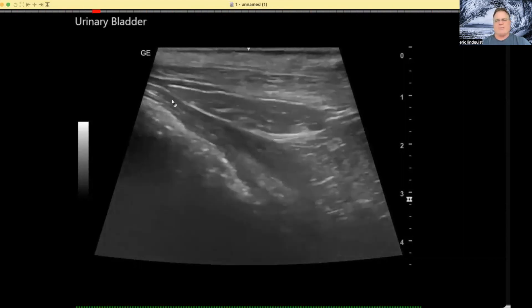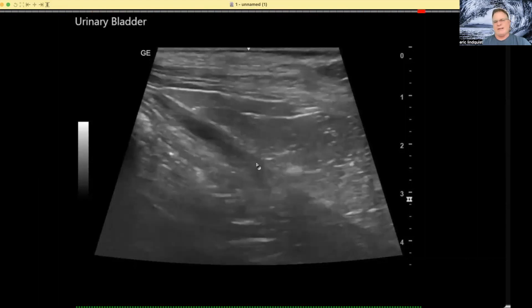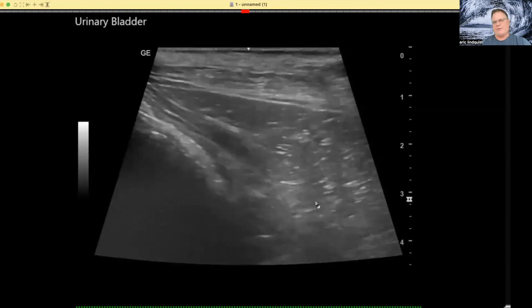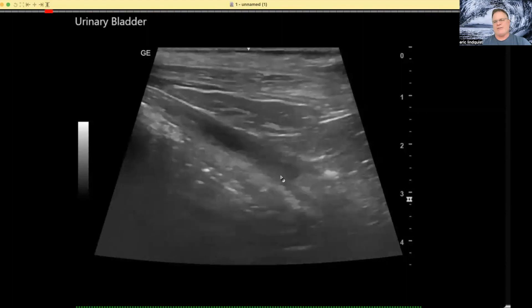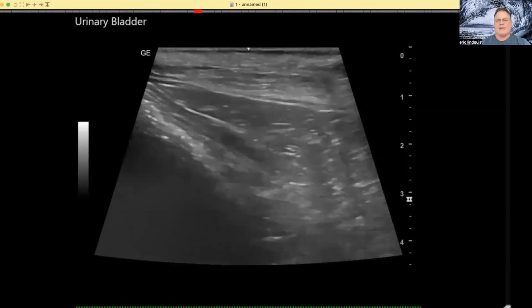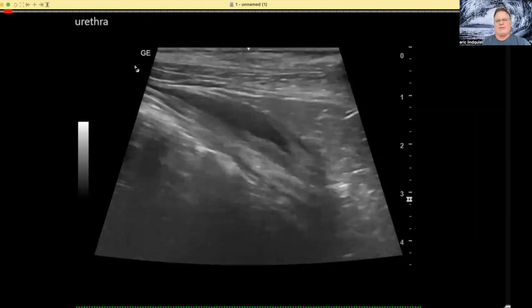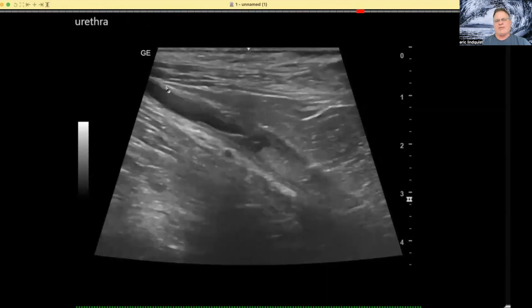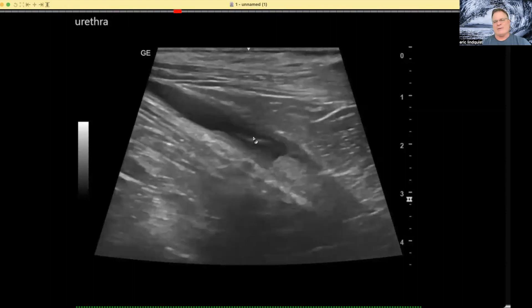Getting into this pelvic urethra, we have about one to two centimeters of depth. Now look what happens down deep into that three to four centimeter urethra — there's something popping up there. This is the area you want to get into, especially when you have clinical signs. You may also find tumors down here incidentally. The colleague adjusted the angle a little bit and pushed on the urinary bladder, which is a nice technique to dilate the urine in the pelvic urethra.